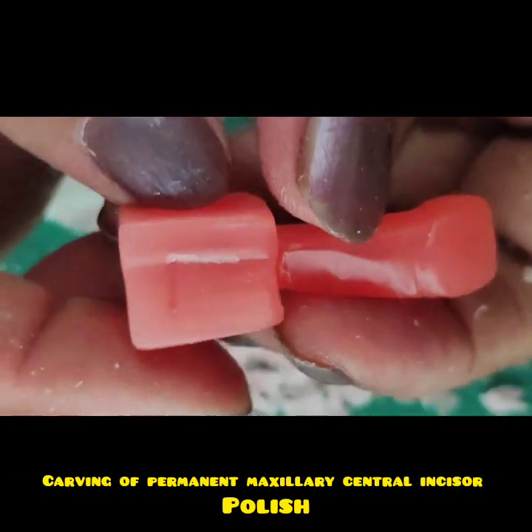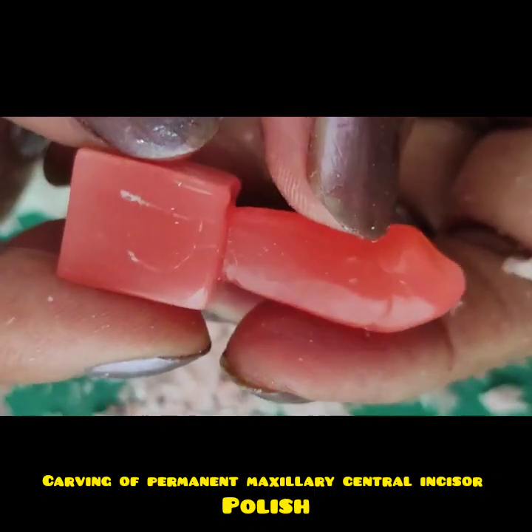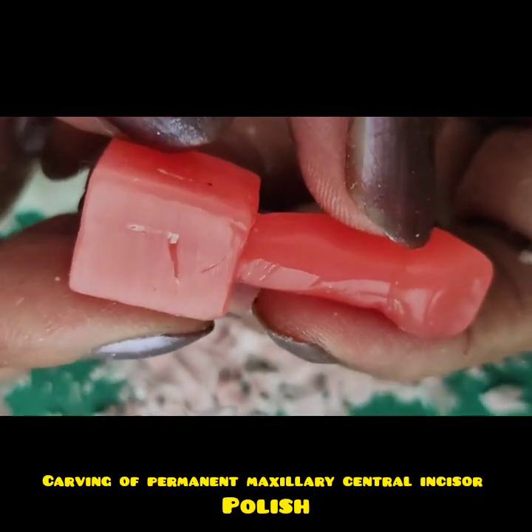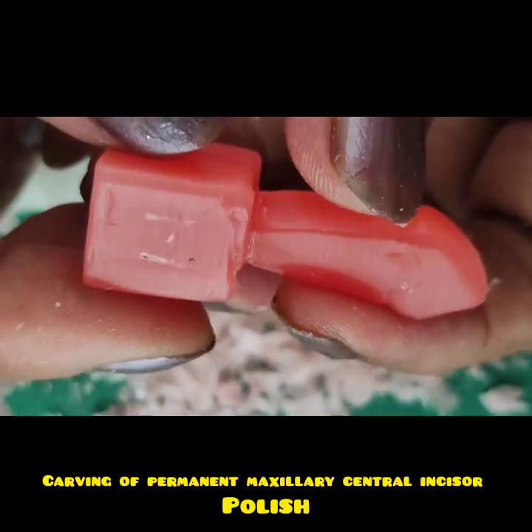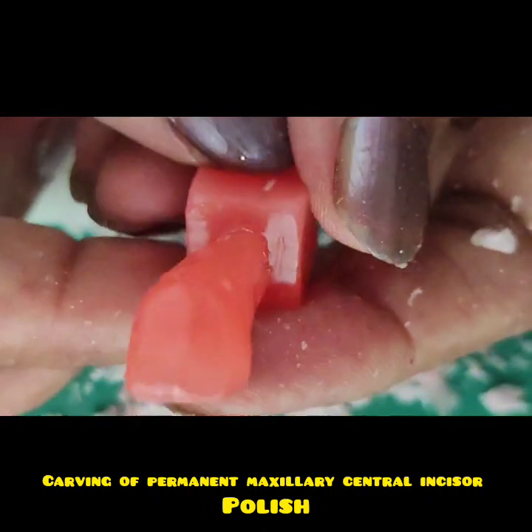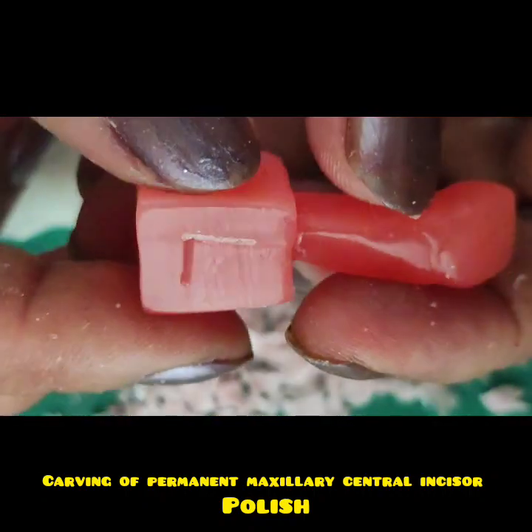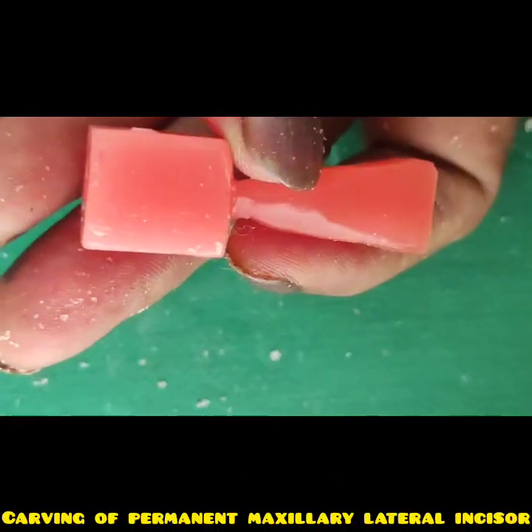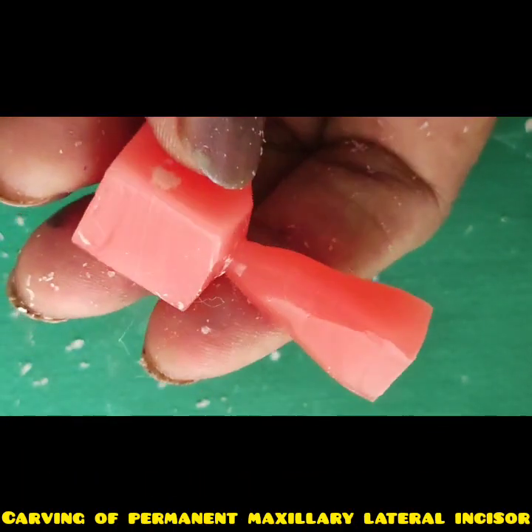So this is how you can see our central incisor is done. This is the labial surface, this is the distal surface, the palatal surface, and the mesial surface. Okay, and this is the incisal view, and this is how our central incisor is done. Thank you. So let us begin with the carving of maxillary lateral incisors.